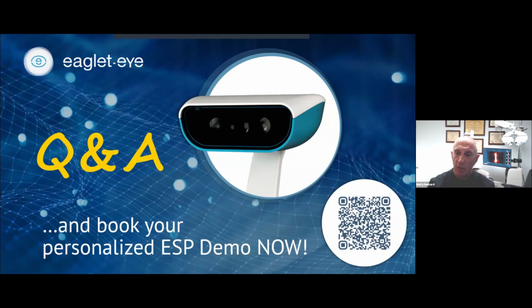The patient's going to come back in the room. I'm off doing something else, so the staff's going to tell me, hey, they're ready for you back in room number 3. I go back in and show that Eaglet design and help go through that design process with the patient, because now we do much more elaborate designs, anywhere from these bioelevations and microvaults all the way to these freeform lenses that can only be done with profilometry.